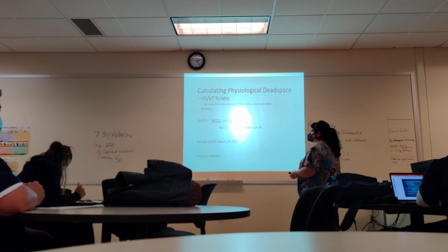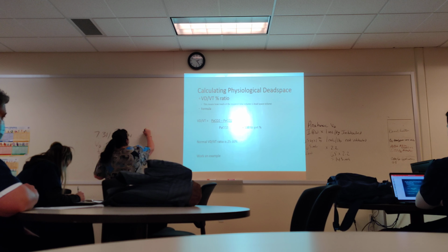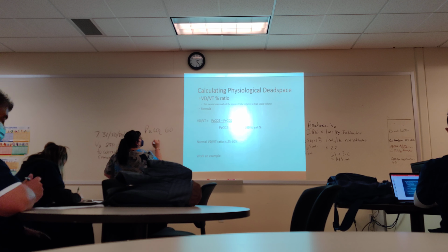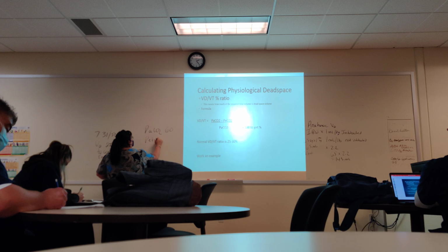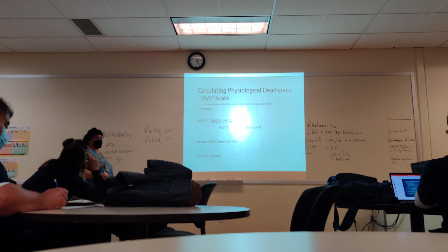So let's try one. Let's say you were told that somebody's CO2 on the blood gas was, let's say, 60. The end tidal is reading at 55. Okay, go ahead and try it. Tell me what you get.